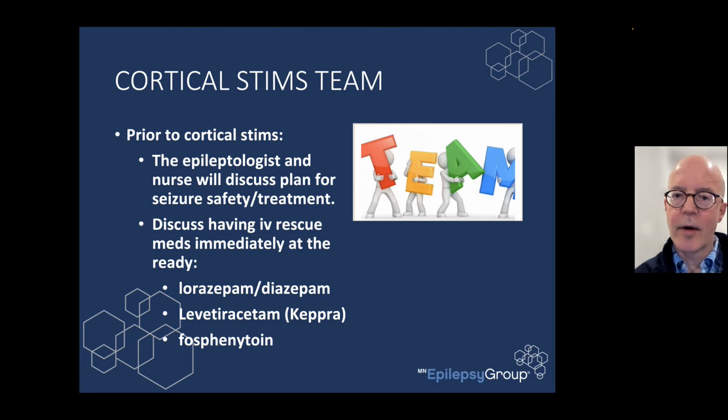You have the rescue meds all available. You don't want to be calling pharmacy to have them send it up. You want these medications either at the bedside or very close to the bedside when we're doing the procedure. That way the patient can be given the rescue medication, the lorazepam, diazepam. Maybe you'll want to have some IV fosphenytoin or IV Keppra close by.